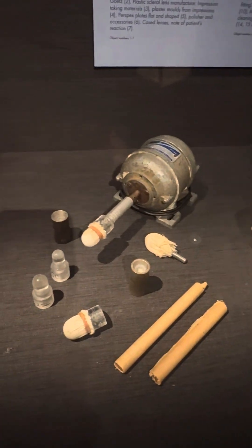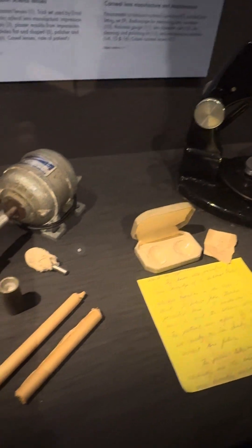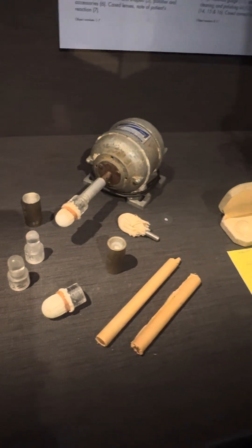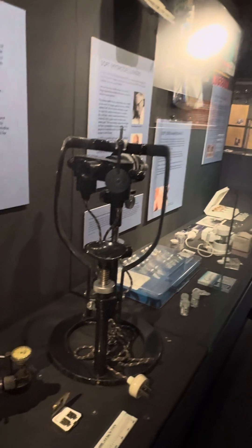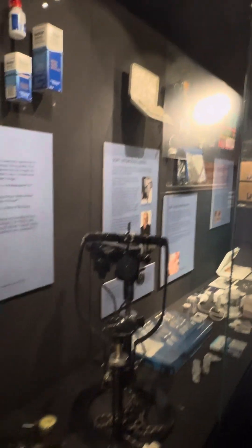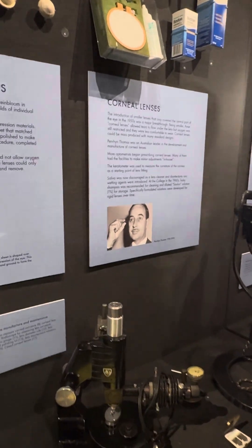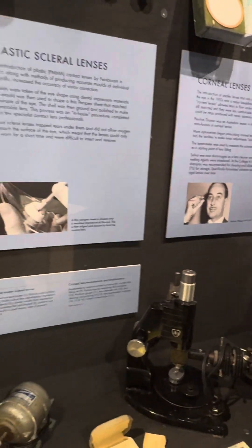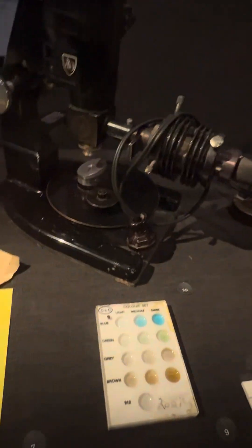There's a pair here that would have been custom-made in the 1960s for a patient. The lady who came in with them said she had them made but hardly ever wore them because they were so uncomfortable. You can see the size of them — you've got to pull your lids right out to get them in. Eventually they moved to smaller hard lenses.